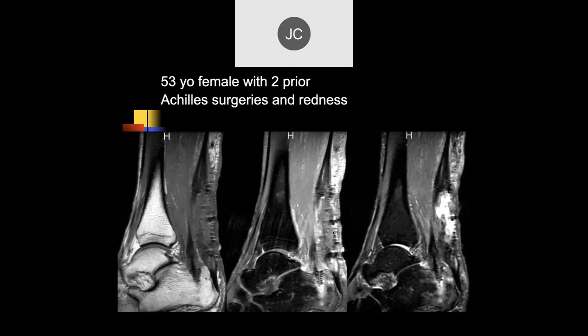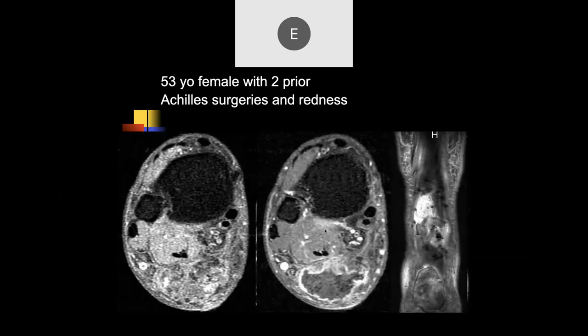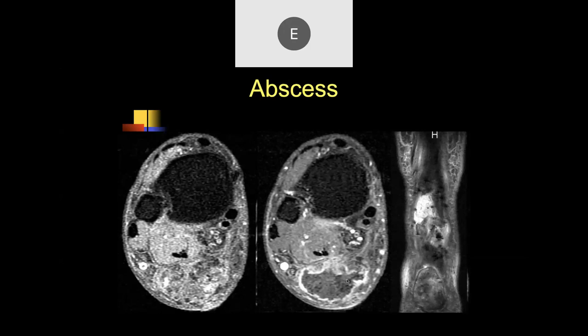A 53-year-old female with two prior Achilles surgeries and redness. There's a susceptibility artifact in the posterior soft tissues — surgical material — and a defect in the native Achilles tendon. There's a surgical screw in the calcaneus, maybe from a flexor hallucis longus transfer, and some edema in the calcaneus. On post-contrast imaging, there's a ring-enhancing fluid collection posteriorly where the tendon should be — this was all infected, a big abscess.